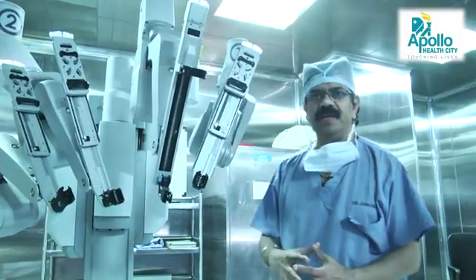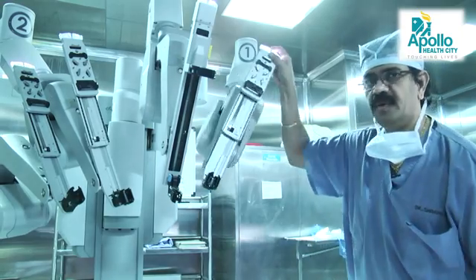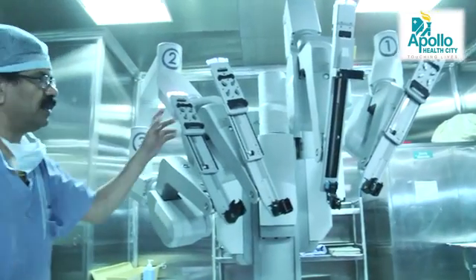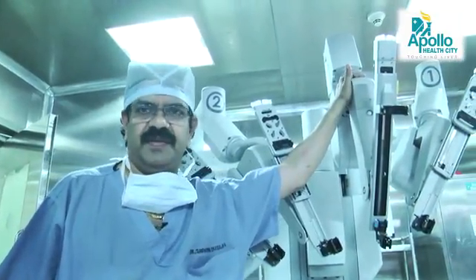The robot has three parts. The main robot has four arms — arm number one, arm number two on this side, and arm number three on the other side — while the central camera is also mounted here. The system we use is the SI system.